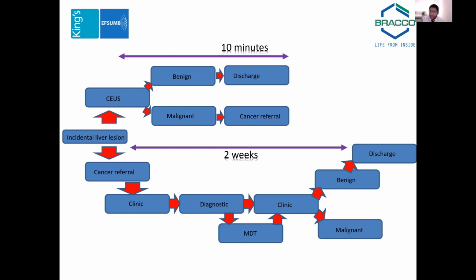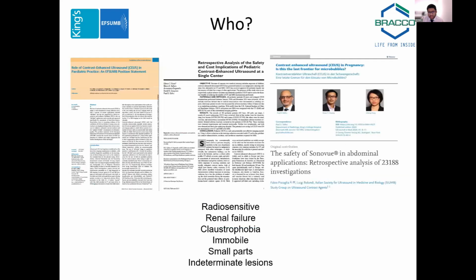And what I emphasize from this slide, you are looking for the benign lesion. Yes, the patients might undergo CT if they have a cancer. Yes, they may undergo CT if they have a metastatic disease. But if they are benign, you are saving them all of that trouble, all of that anxiety, and you're preventing them from having unnecessary examinations. Your hospital will thank you.